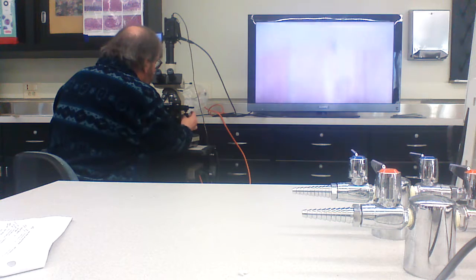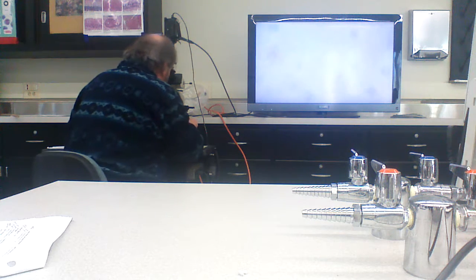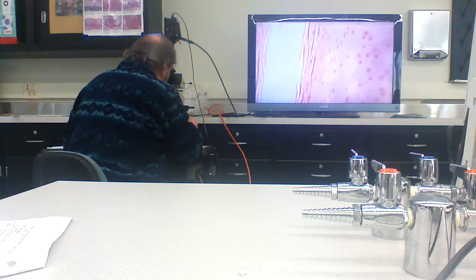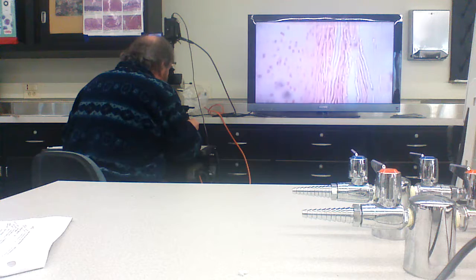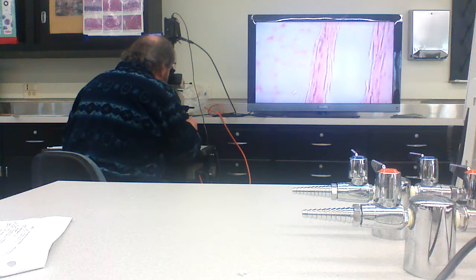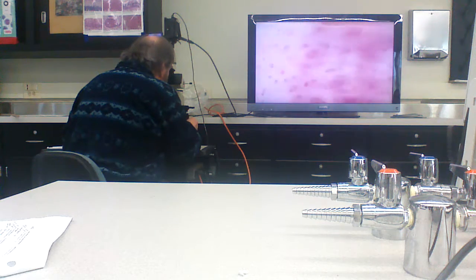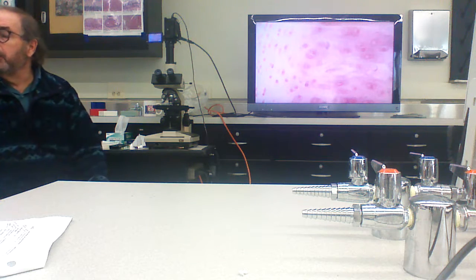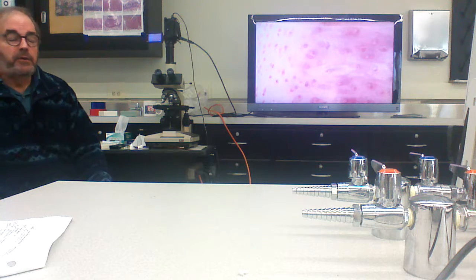Even though there is a network of elements in there, you don't see it. So this is, right, but it's stiff and it doesn't deform very well. Right? Stiff and it resists compression.